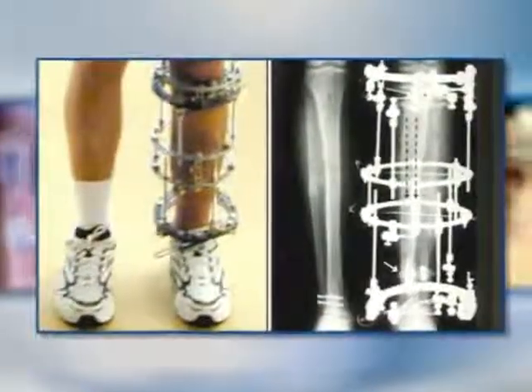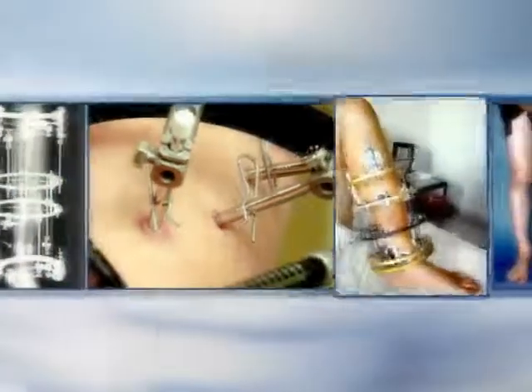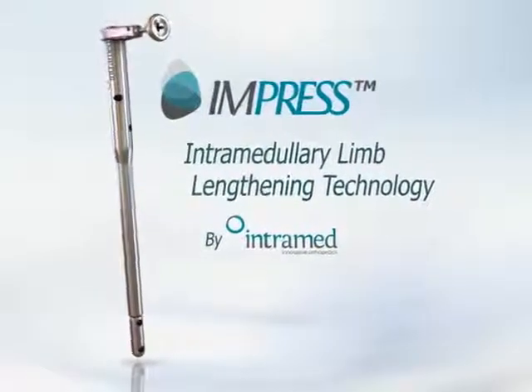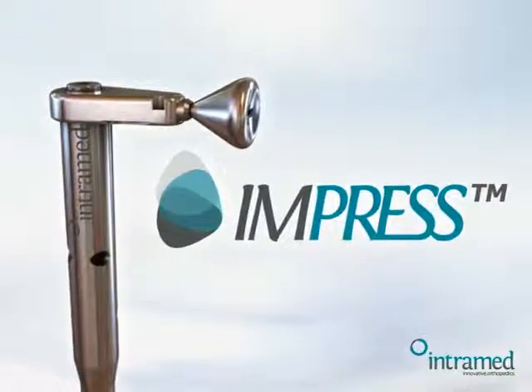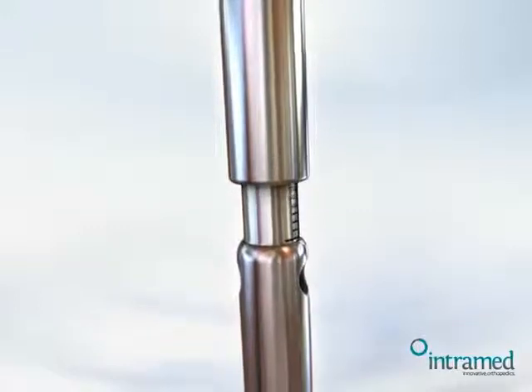For the last 30 years, elongation devices have been uncomfortable, infection prone and uncontrollable. All this will now change with a new groundbreaking device — the Impress system from Intramed: an innovative limb correction, reconstruction and elongation device.